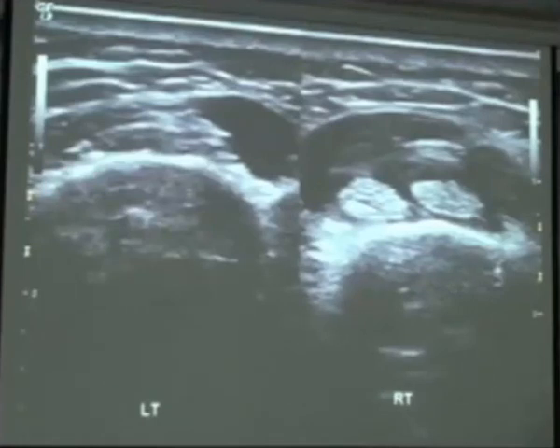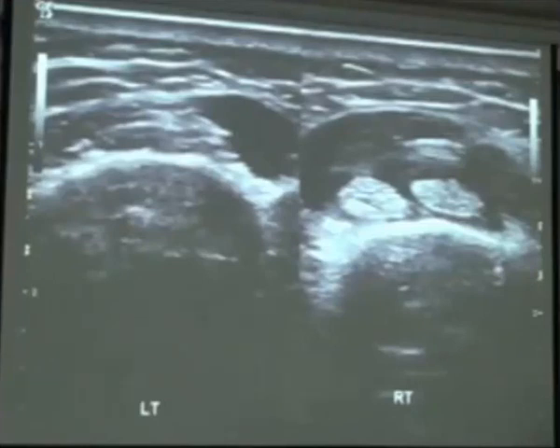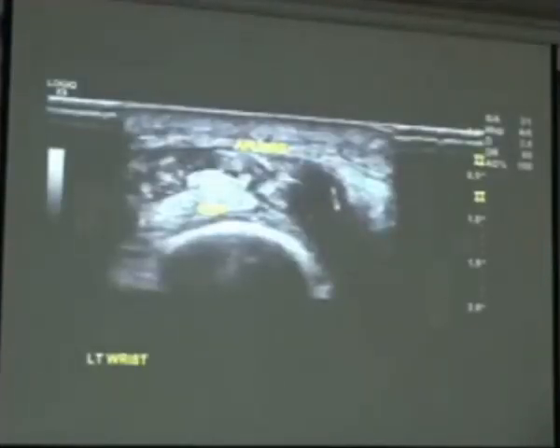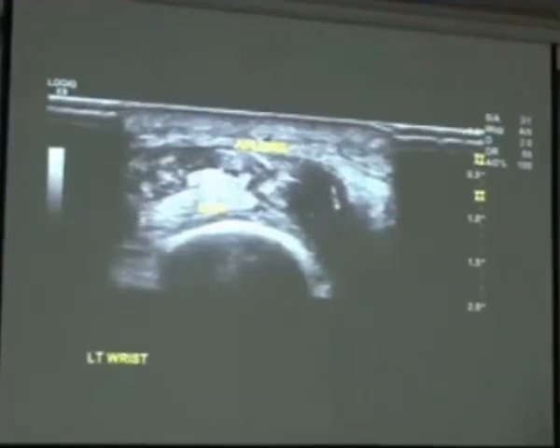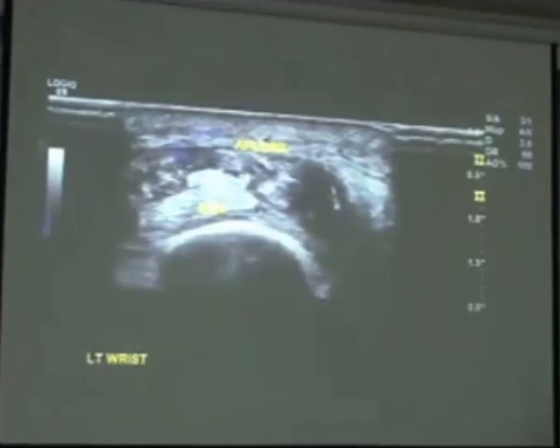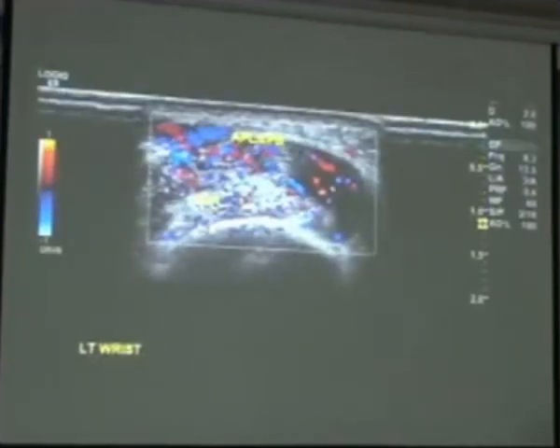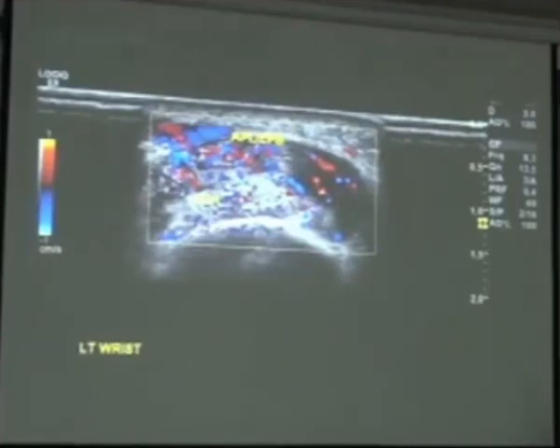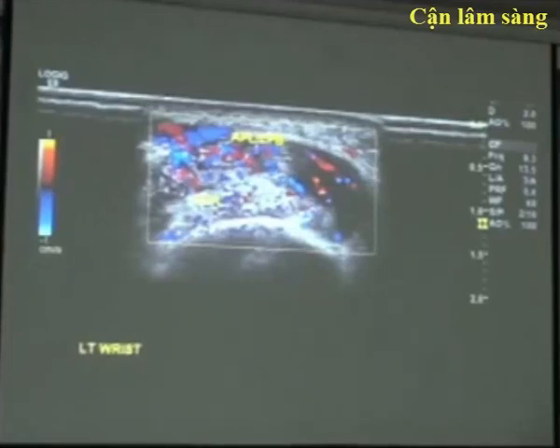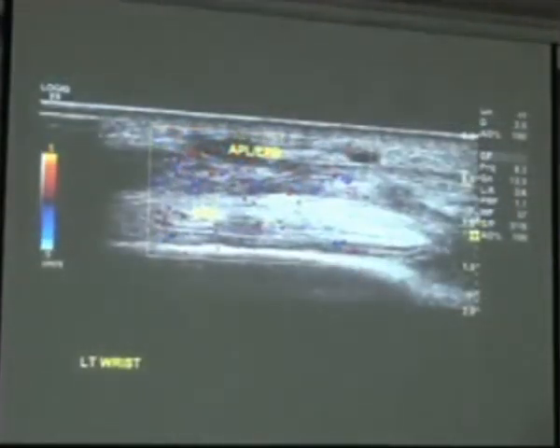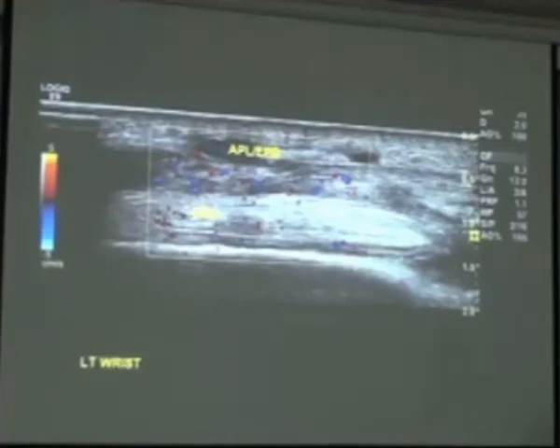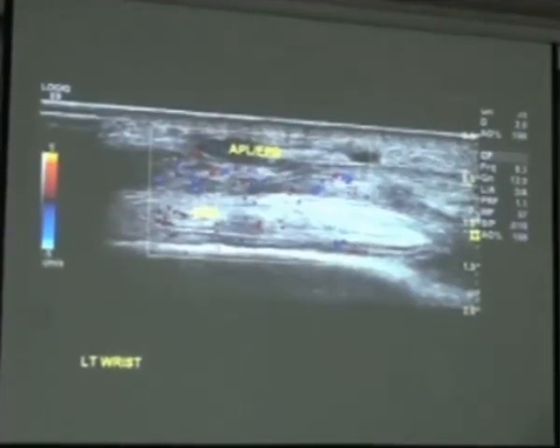The comparative view using dual-screen imaging is very helpful for diagnosing intersection syndrome. In another case, you can see the APL and EPB coming across the ECRL with significant hyperemia in that area, as well as interstitial edema indicating soft tissue irritation. In longitudinal plane, we have the APL and EPB muscle crossing in short axis over the long axis of the ECRL, with all of that edema and hyperemia clearly demonstrated.